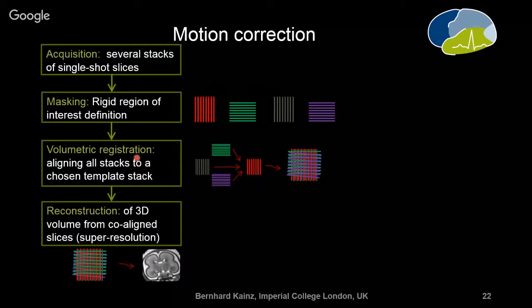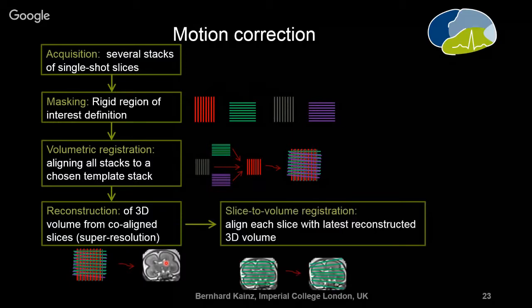What we do is we first try a partially reconstructed volume by applying techniques like super resolution and co-aligned slice alignment with point spread functions, which gives us, I wouldn't call it average, but something like an initial guess of how our structure could actually look. It doesn't look like this. This is already a very late stage of the reconstruction. It looks more like a very, very blurry and corrupted version of that. But it's usually good enough to at least figure out where brighter and darker areas are, so that you can start some kind of registration and realignment of the slices.